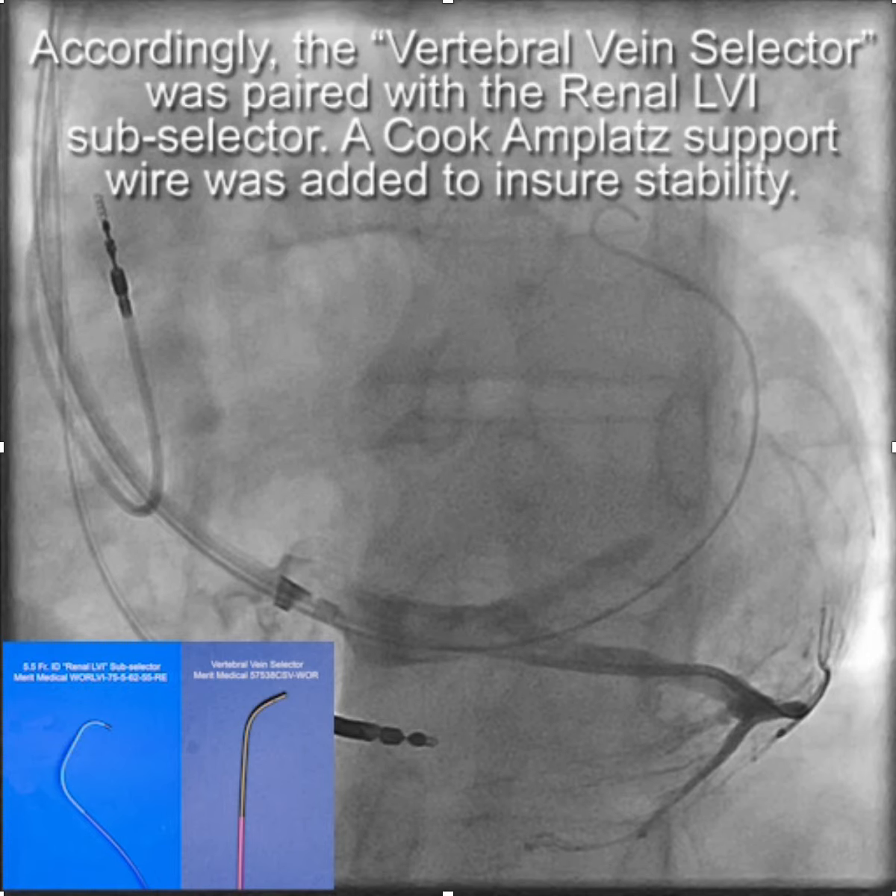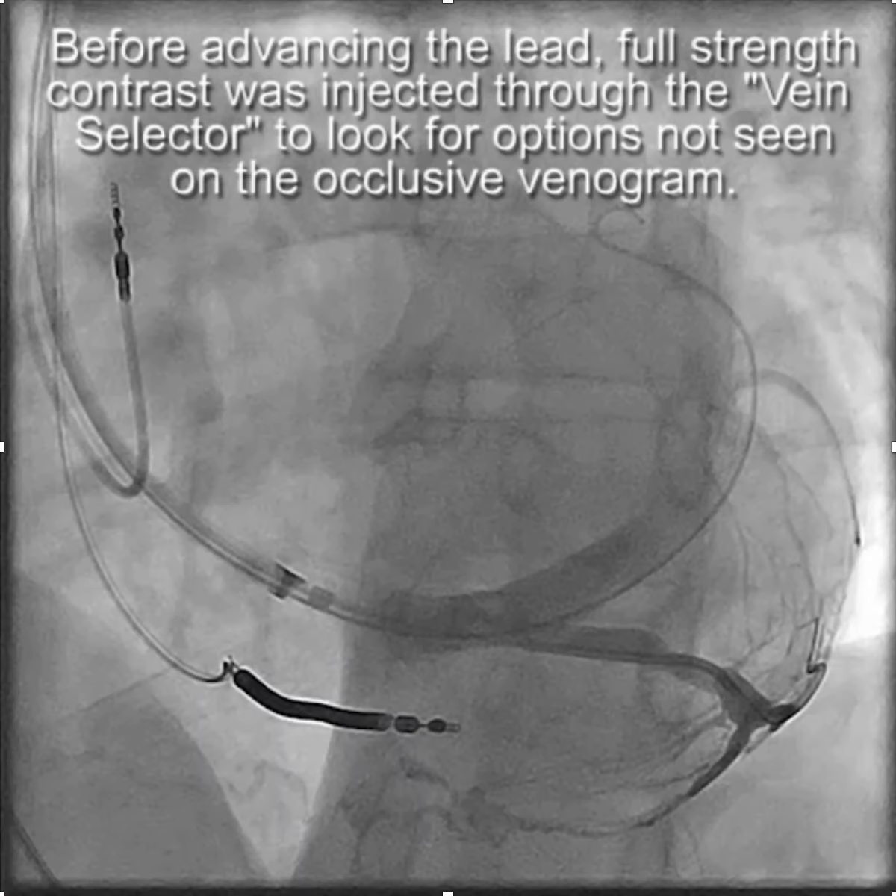Before we put the lead in, we injected full-strength contrast through the vein selector to determine whether there might be other options for LV lead placement, in case the LV lead in this branch didn't give us satisfactory results.